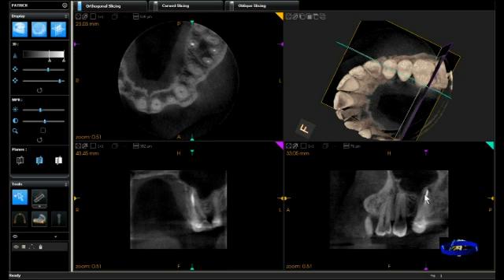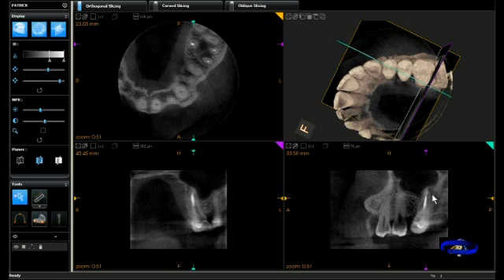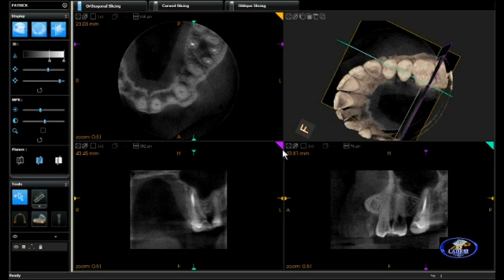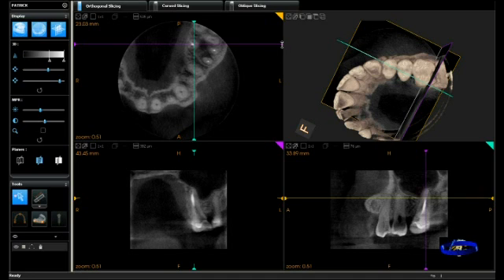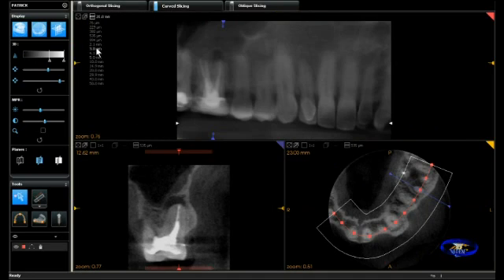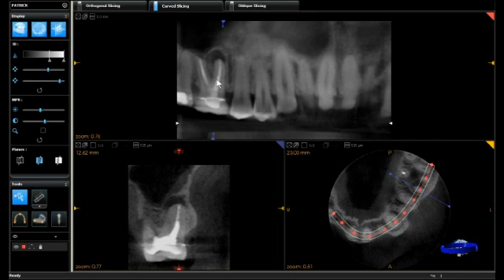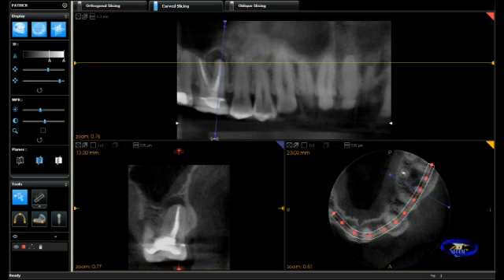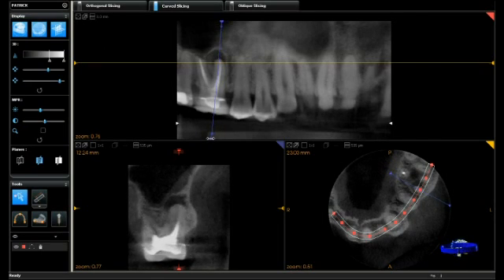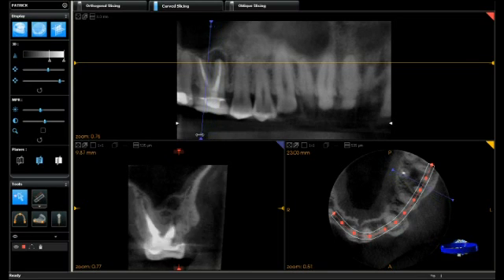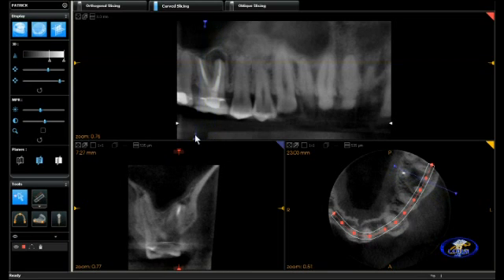Here we can see the distal buccal root in the lower right. Now we'll be looking at the palatal root in all three dimensions. At this point we'll go to curved slicing, which gives us a panoramic representation of the area, and we can view a cross-sectional analysis through each root.